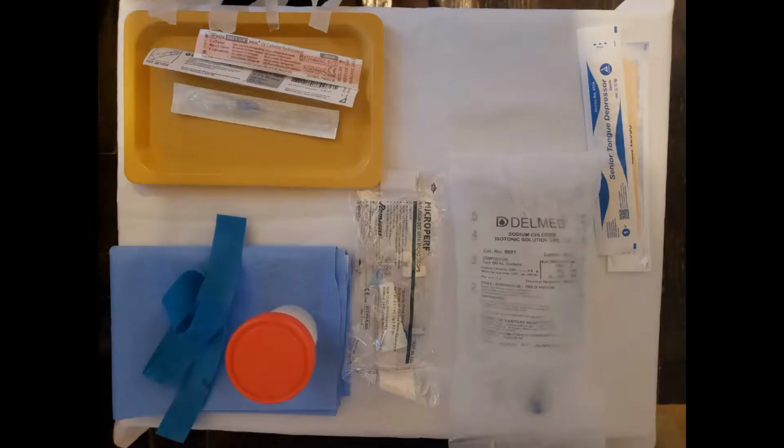I have here some swabs in a container, a pad to put under the patient's limb, a tourniquet, options for Intracath sizes because I will evaluate which I can use when the process is started. In this case, 500 ml of fluids will be hung and the tubing that's needed for the connection. My trash and sharps container are located just within reach so that I can readily dispose of the sharps and keep both myself and the patient safe.